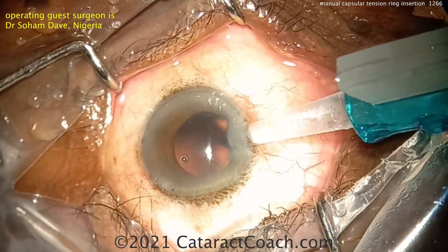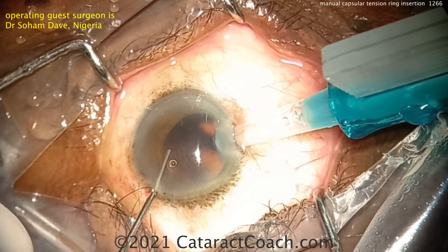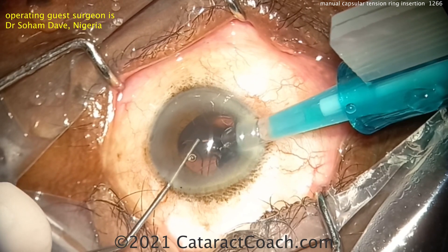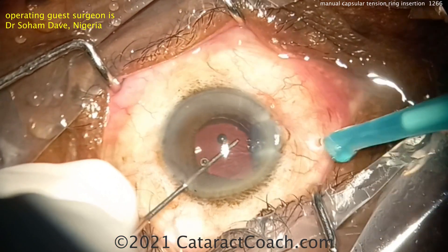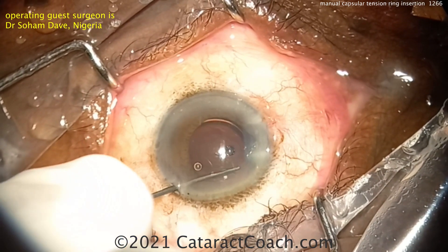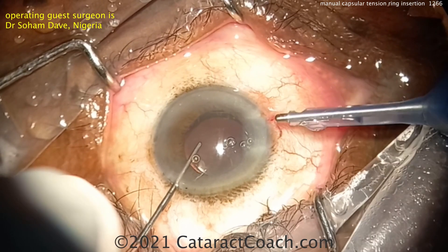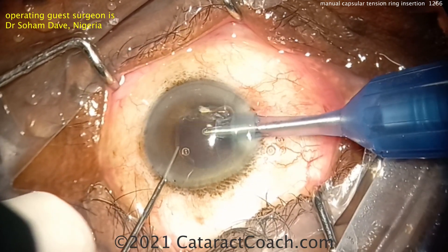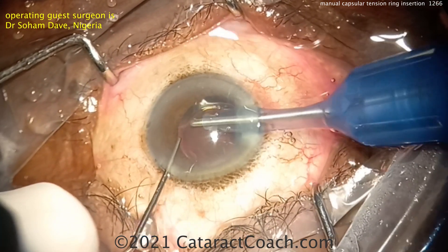Here's the lens going into the capsular bag. Once you have the CTR in, you can put a single-piece acrylic lens in the bag — its orientation doesn't really matter much because the CTR provides 360 degrees of outward support on the capsular bag equator. Finishing up now — removing the viscoelastic from the eye. That's a really nice looking case.